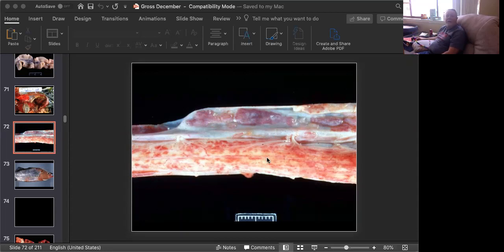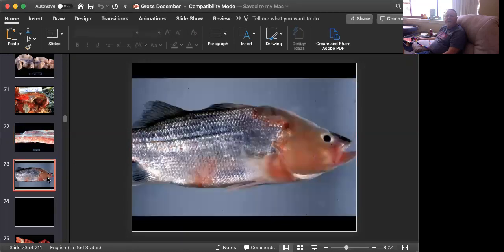And then finally, here's our quarantine special, slide number 10. And this is a fish. Probably somebody out there knows what kind of fish it is. Looks like salmon of some type. But this fish needs a shave and it needs a haircut. Can you give me a morphologic diagnosis and a cause? This fish has been in quarantine like we all have for a while, and it needs to see a barber, I think.